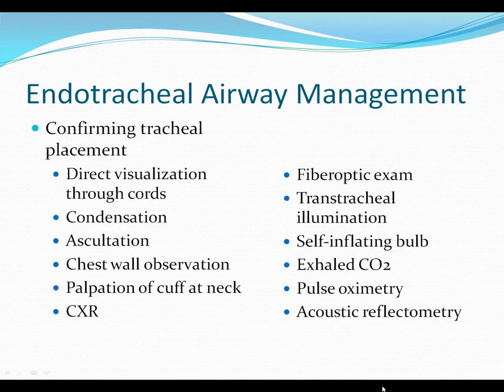Alright, you've probably heard many ways of confirming placement. The best way is direct visualization of the cords and persistent exhaled CO2. There's a whole bunch of other stuff you can do. You can look for condensation, you can listen for breath sounds, chest wall observation, palpate the cuff at the neck. Has anyone done that?